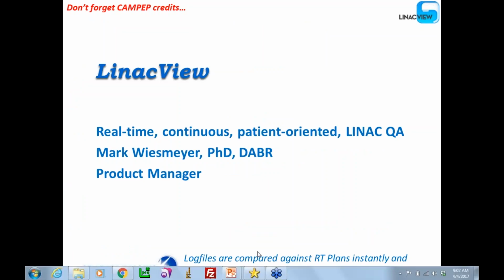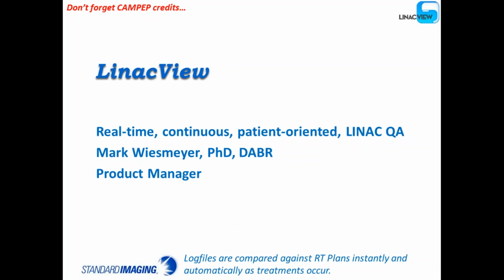As I mentioned, my name is Mark Wiesmeyer. I'm the product manager for LinacView. It's a really unusual and interesting program. What it does is it compares in real time your RT plans to your log files. It does this in a continuous way. It's patient-oriented, and it's basically Linac QA on a patient-by-patient basis. It's very much behind the scenes and has essentially no impact on your clinical workflow. As I said, log files are compared against RT plans instantly and automatically as treatments occur.